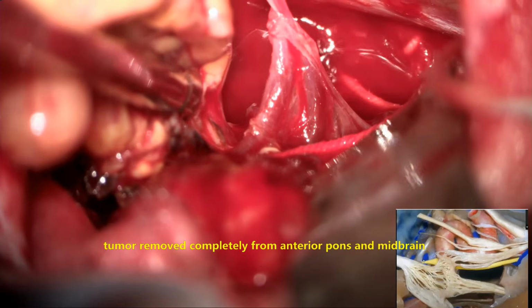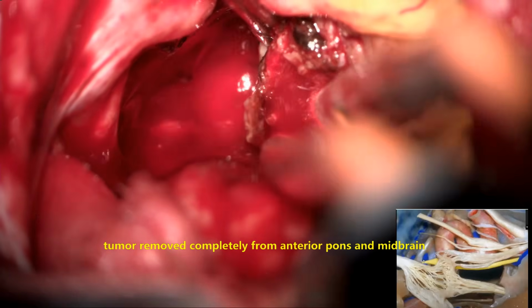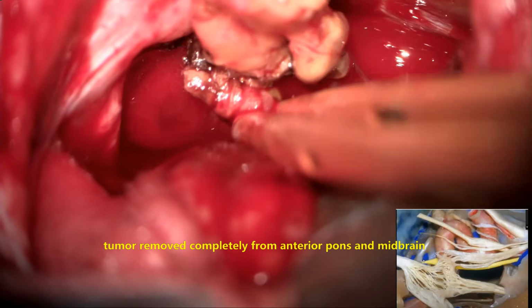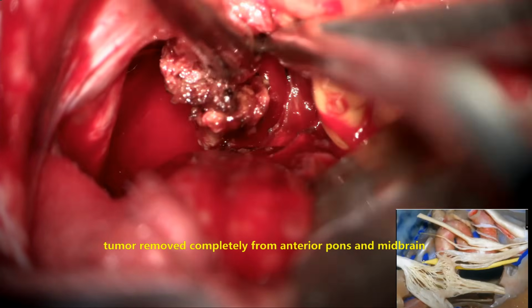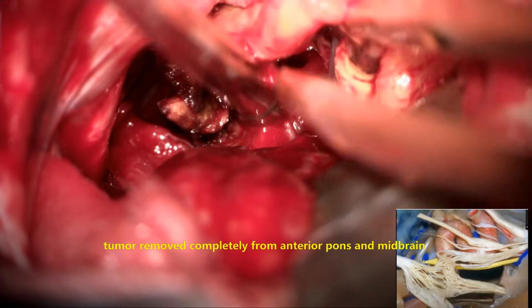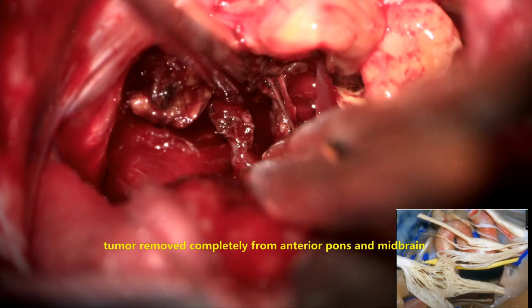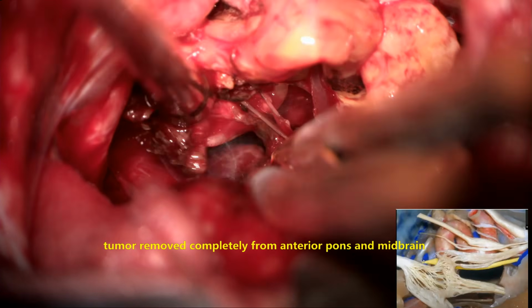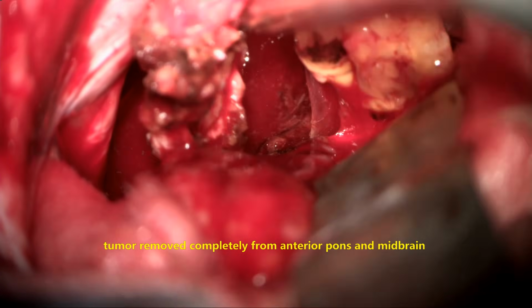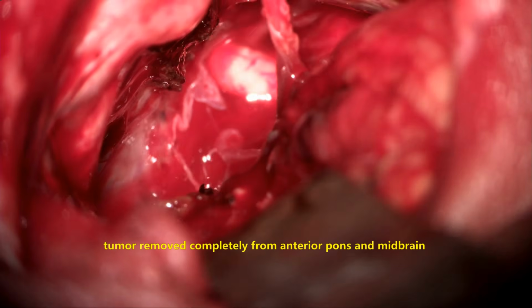That's the medialmost part adherent to the pons, which is coagulated and cut with sharp dissection and removed. That is the part of the tumor which is medialmost, adherent to the pons in the arachnoidal plane. That plane needs to be maintained always. Here we may have some bleeding from the surface of the capsule. All our coagulation should be on the surface of the capsule and not towards the brainstem. And that is the complete excision. That's the tumor arachnoid which is removed.